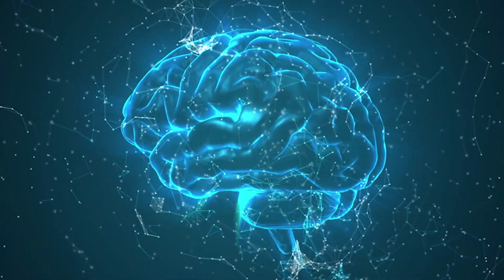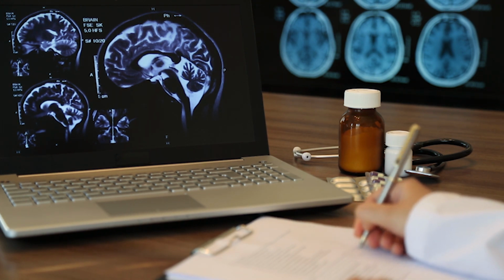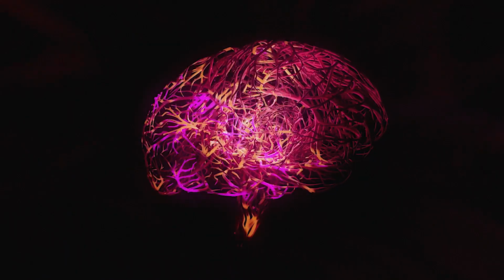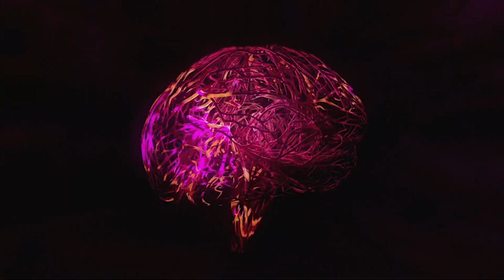And brain regions cannot get activated until blood flows there, actually fresh blood, oxygenated hemoglobin, a hemoglobin that has iron as well as oxygen in it. And the oxygen is the reason why the iron in the hemoglobin gets neutralized. So oxygenated hemoglobin doesn't distort the field, but deoxyhemoglobin actually distorts it. So whenever a brain region gets activated, deoxyhemoglobin gets pushed out. So the source of distortion gets pushed out, and oxyhemoglobin is brought in, and replacing deoxyhemoglobin with oxyhemoglobin increases the signal because the source of distortion has left the scene. And this is why fMRI is a very powerful way of looking at how different brain regions get activated.